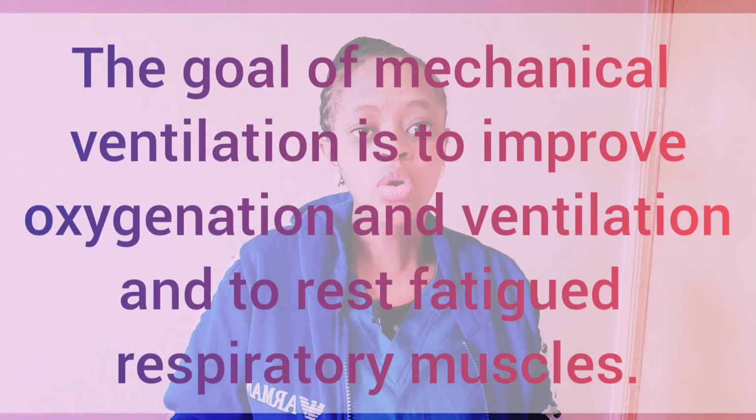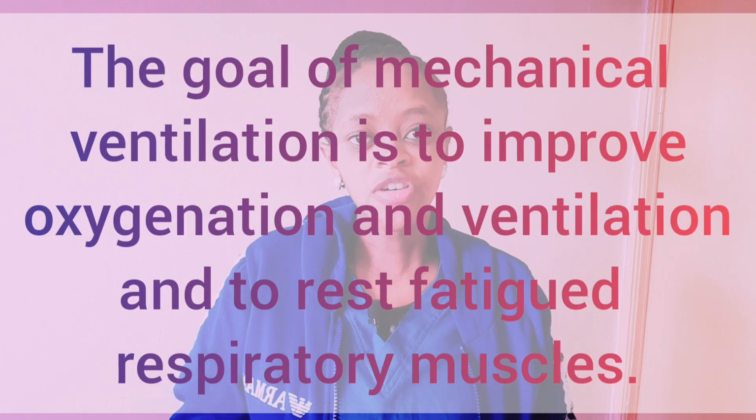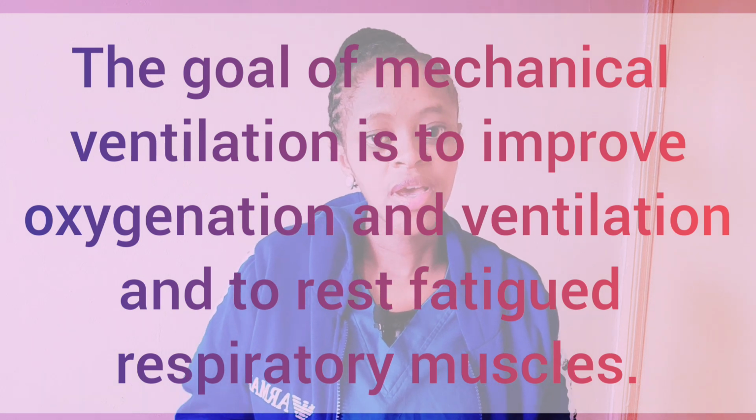ventilation. Endotracheal intubation and mechanical ventilation may be prescribed for patients who can't maintain adequate oxygenation or ventilation or who need airway protection. The goal of mechanical ventilation is to improve oxygenation and ventilation and to rest fatigued respiratory muscles. Mechanical ventilation is a supportive therapy because it doesn't treat the causes of the illness and associated complications. However, the ventilator support buys time for other therapeutic interventions to work and lets the body reestablish homeostasis.